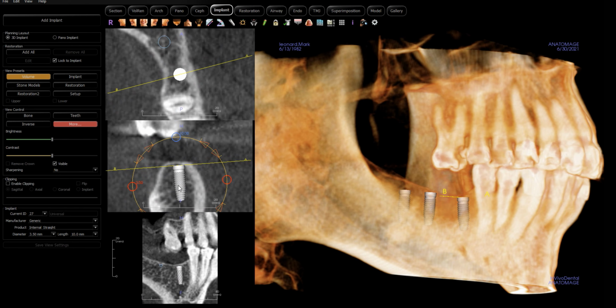It doesn't make sense when we have the ability to move the implant to put the patient through significant ridge augmentation. Each ridge or each site for ridge augmentation runs the patient anywhere between $3,000 and $5,000 and anywhere between 6 and 12 months of healing. Not to mention it's technically challenging. The outcomes sometimes aren't ideal. If we can, we try to avoid doing ridge augmentation.